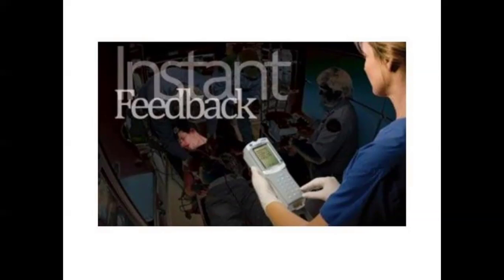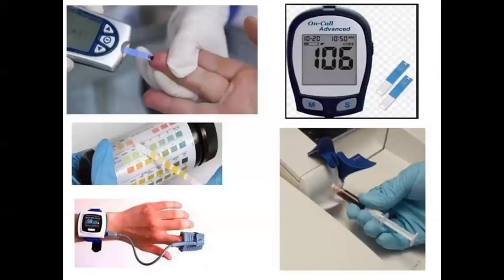Or like a glucometer where we put a drop of blood to the strip and instantly it gives you the reading. So this kind of instant feedback or instant result that you get from the device is called a point of care device. So these are some examples. The bottom one is a pulse oximeter. Most of us would have come to know what a pulse oximeter is during the COVID times because most of us purchased one and there were even offers on the pulse oximeter.